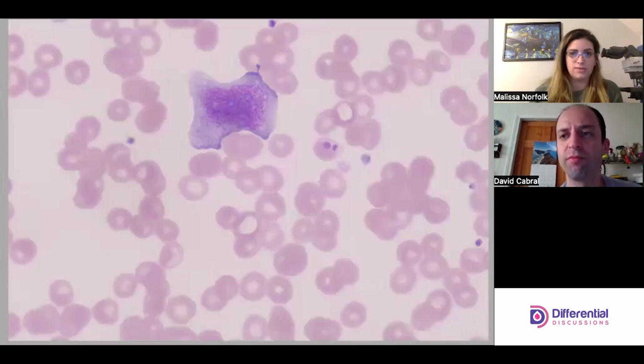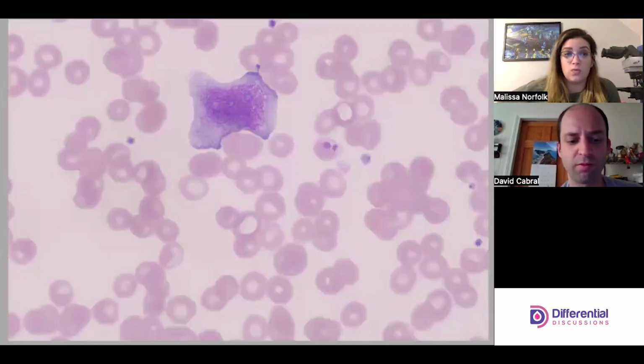It's stopping the process and becoming a remnant, and then eventually it goes away. But the other two look like distinct, clear nucleoli. Pro-monos don't usually have this many nucleoli, even in leukemias, but I'd say it has more characteristics of a pro-mono than anything. That's what I would think too.